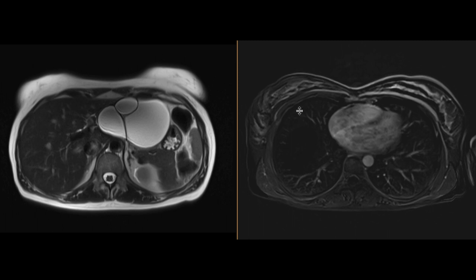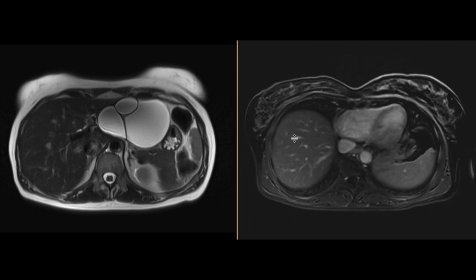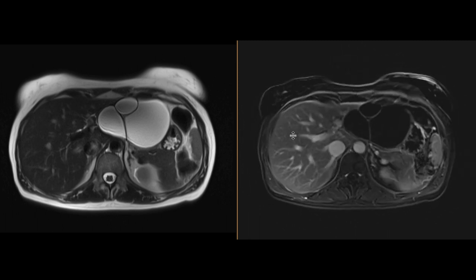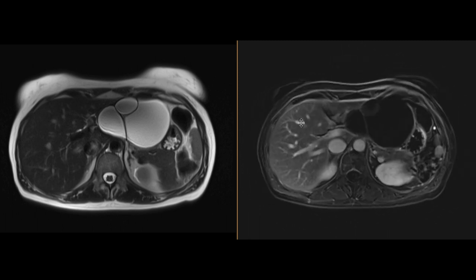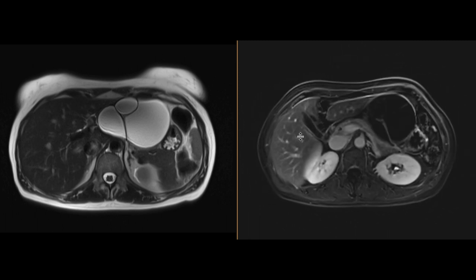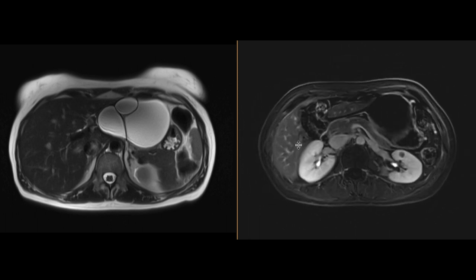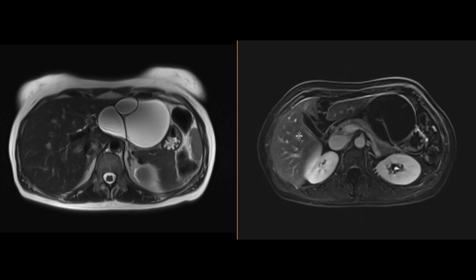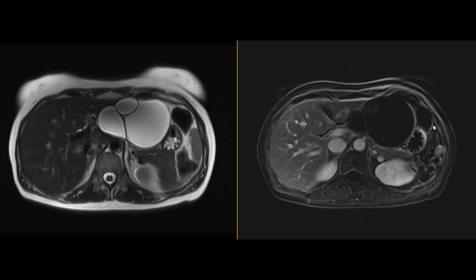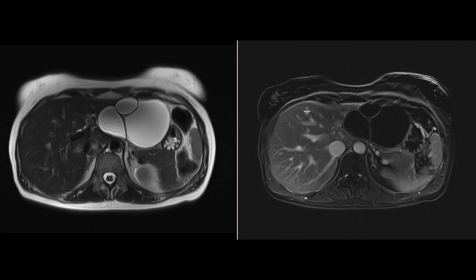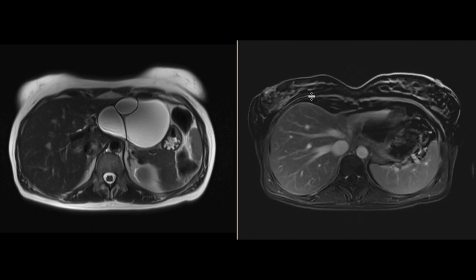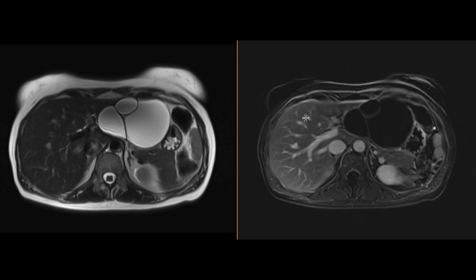On our post-contrast subtracted image, we note that all these septations are enhancing — some are thickened, some are nodular — but we're not really seeing discrete soft tissue components associated with this cystic mass.